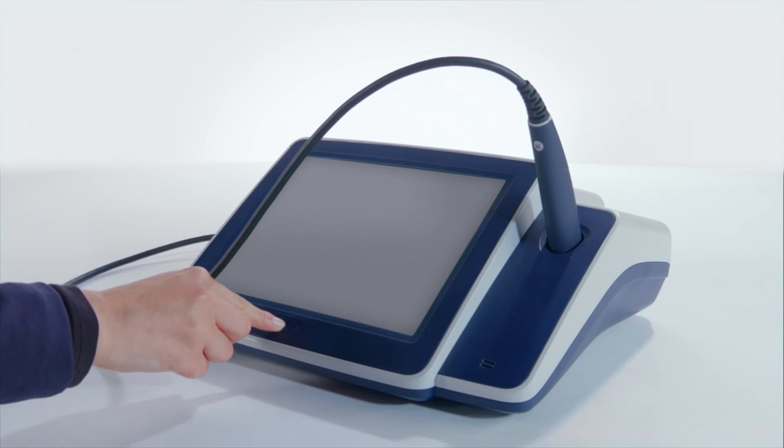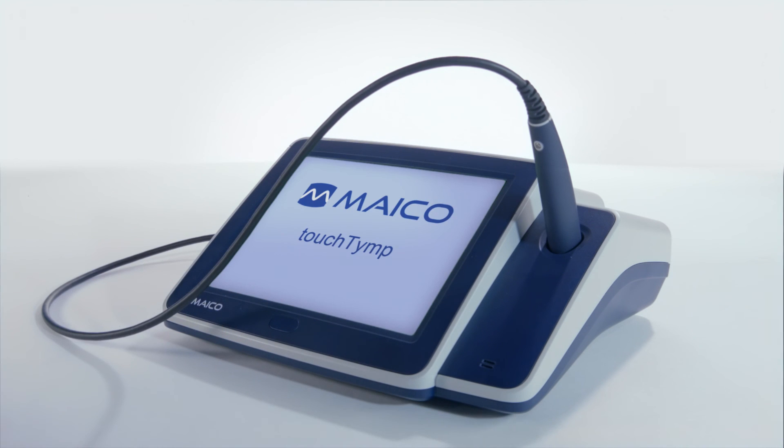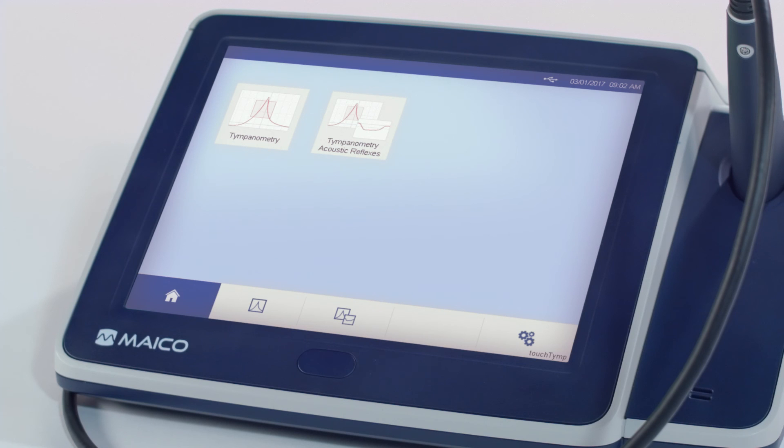To turn on the touchTymp, press the blue button on the front of the device. The touchTymp will load the settings and once completed, the home screen is displayed.